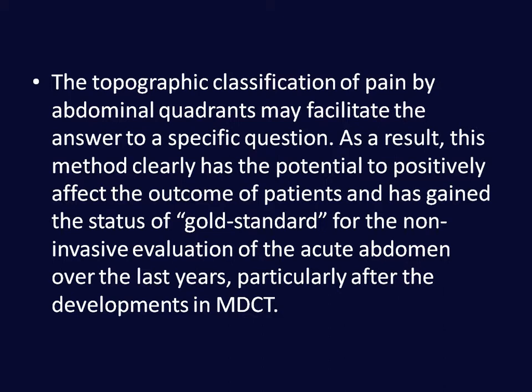And this method has the potential to positively affect the outcome of patients and has gained the status of gold standard for the non-invasive evaluation of acute abdomen over the last few years, particularly after the development of multi-detector CT scan. Thank you very much.